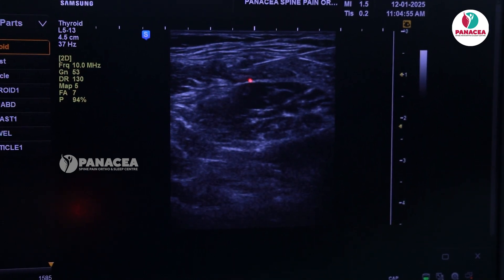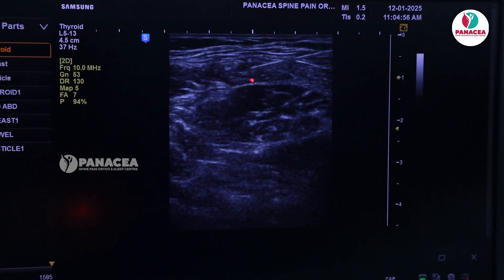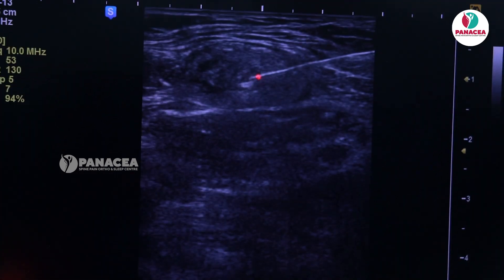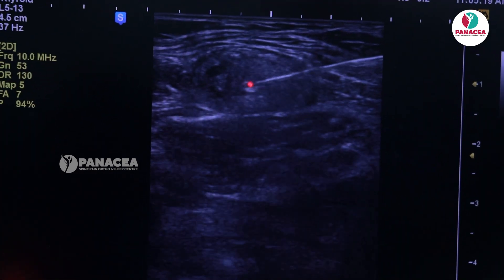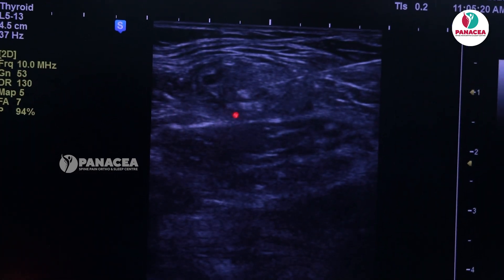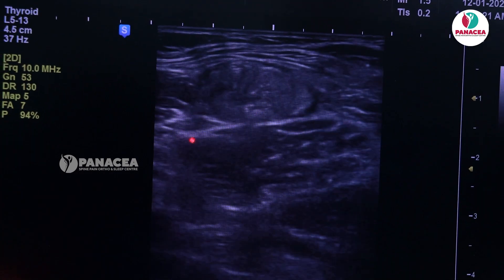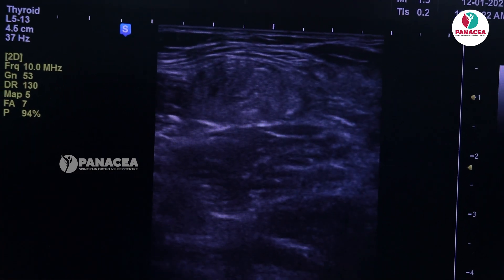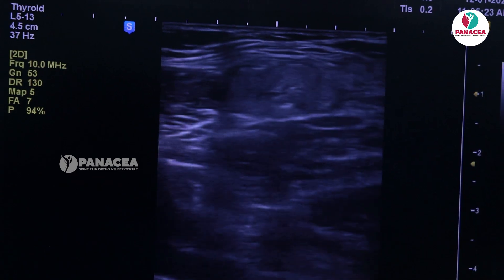We are now injecting the drug into the LFCN block site.